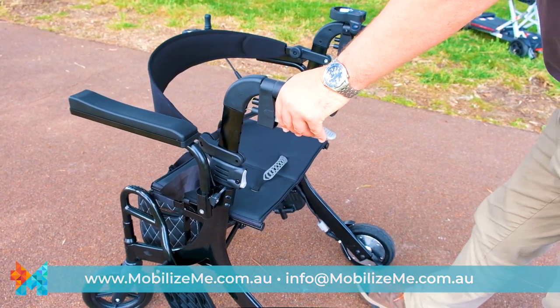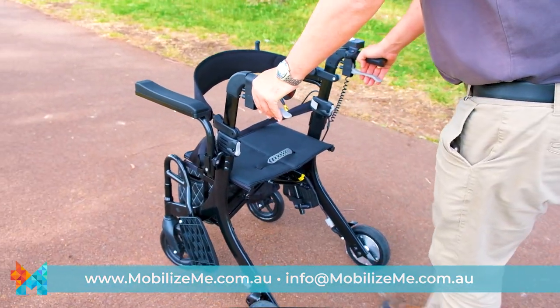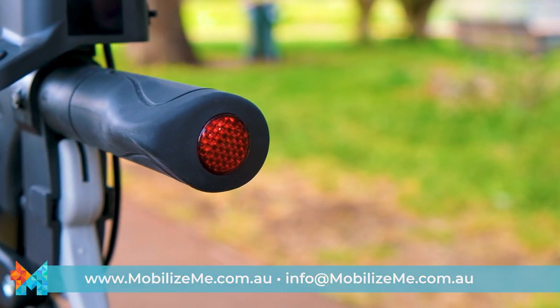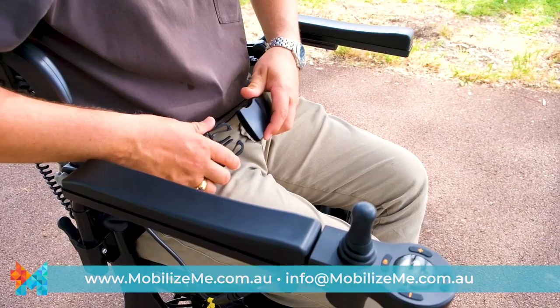Like all rollators, the Evo is fitted with manual lockable brakes for situations when the motor is turned off. There are also added reflectors and a seatbelt for additional safety.